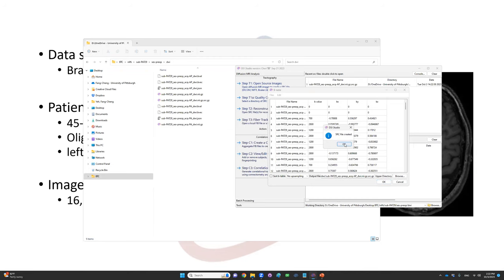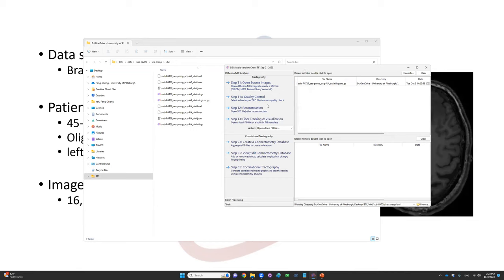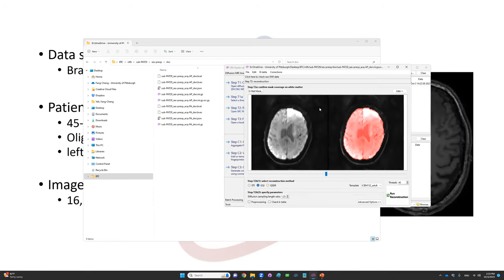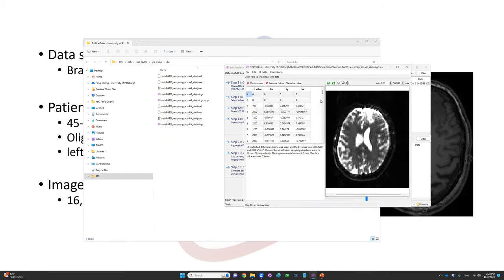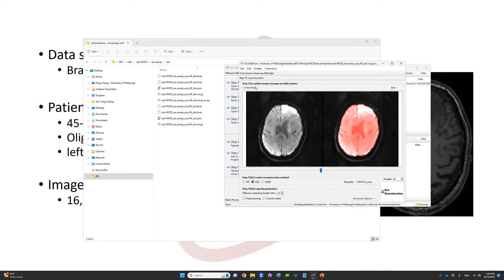Once the SRC file is constructed, click on the second step, the reconstruction step, and open the SRC file we just generated. Once we open this SRC file, it will show a window showing the mask. Before we go into reconstruction, we can click here to check raw data.